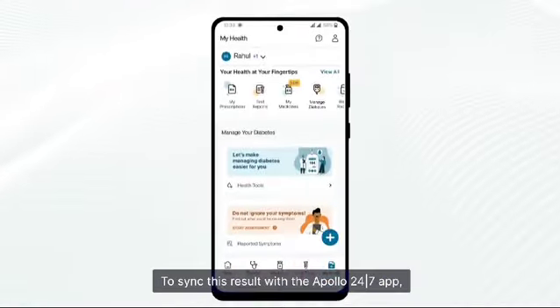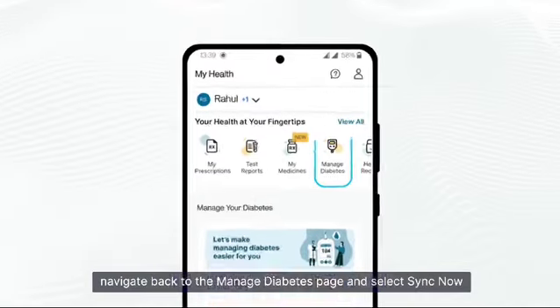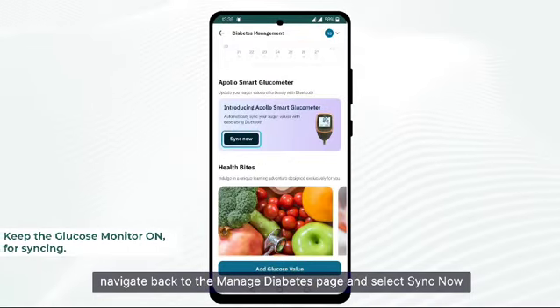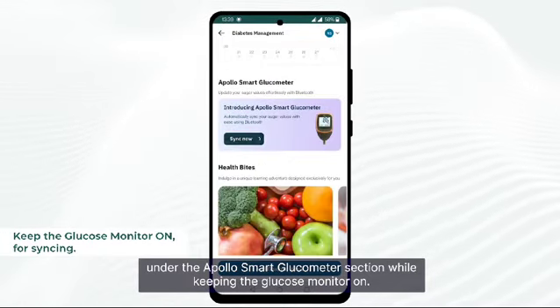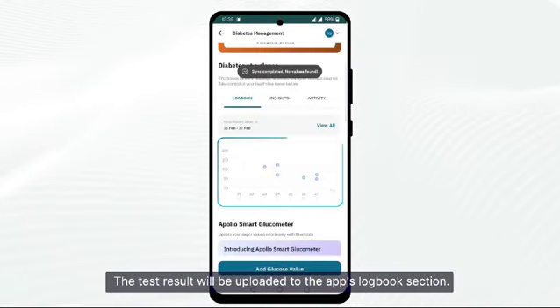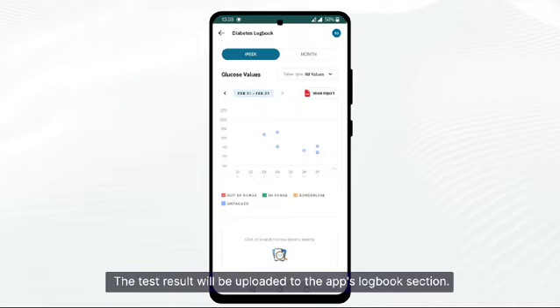To sync this result with the Apollo 24/7 app, navigate back to the Manage Diabetes page and select 'Sync Now' under the Apollo Smart Glucometer section while keeping the glucose monitor on. The test result will be uploaded to the app's logbook section.